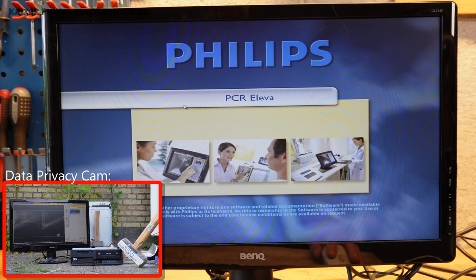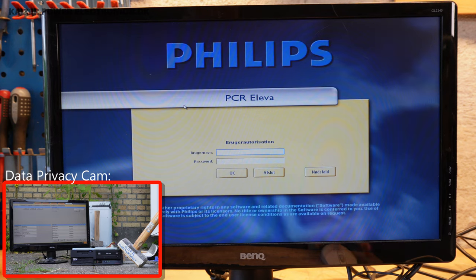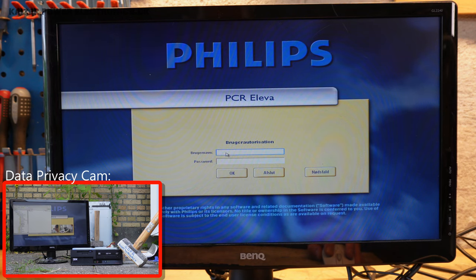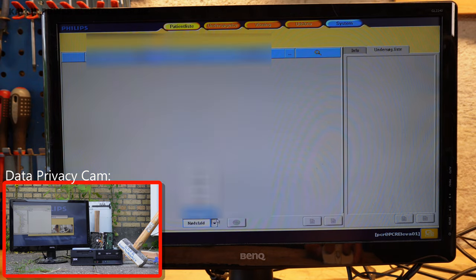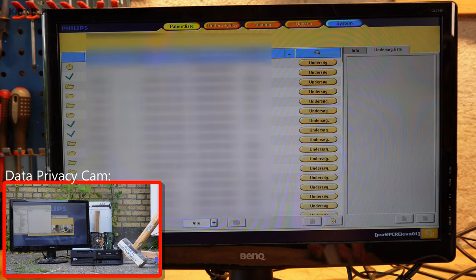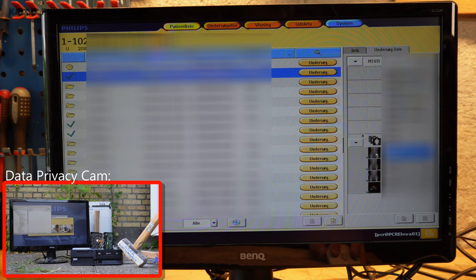We have a login prompt. The sticker on the front of the PC said PCR — maybe it's the username, or maybe the username and password. Oh wow, it's chock full of actual images that have been scanned. There are actually pictures in here. What can I do here? Can I press this?